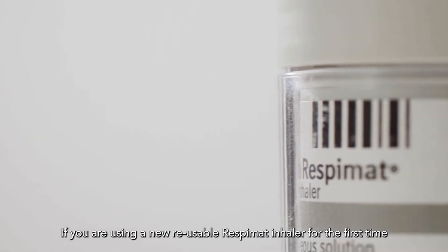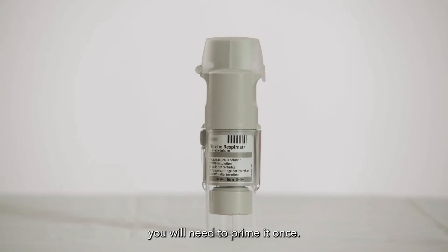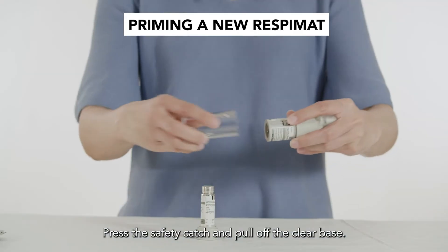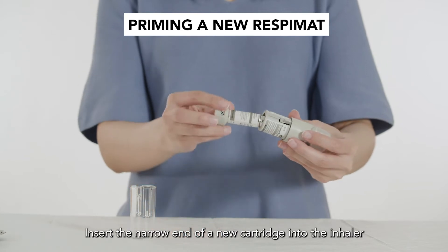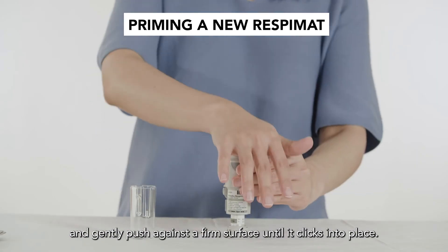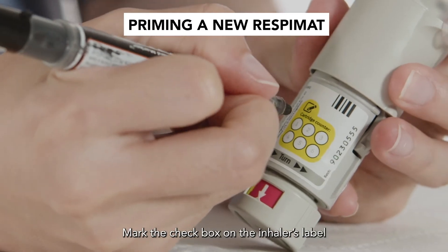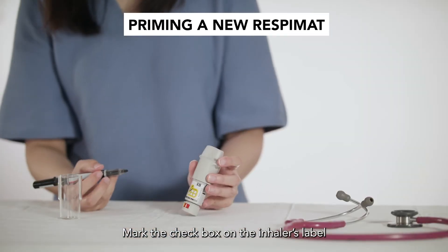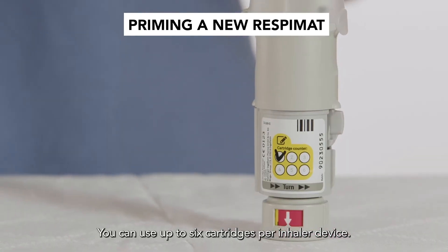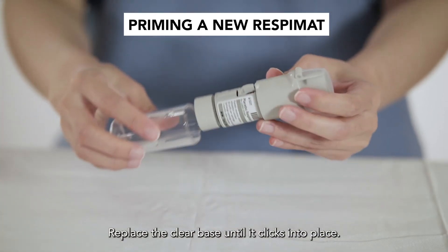If you are using a new reusable respimat inhaler for the first time, you will need to prime it once. Keep the cap closed. Press the safety catch and pull off the clear base. Insert the narrow end of the new cartridge into the inhaler and gently push against a firm surface until it clicks into place. Mark the check box on the inhaler's label to track the number of cartridges. You can use up to 6 cartridges per inhaler device.